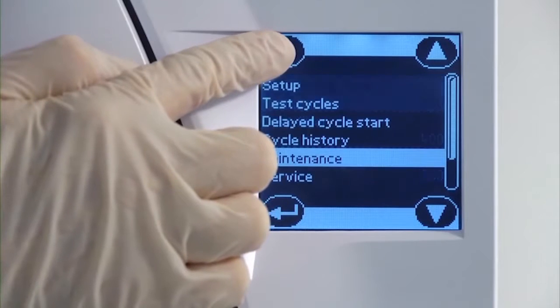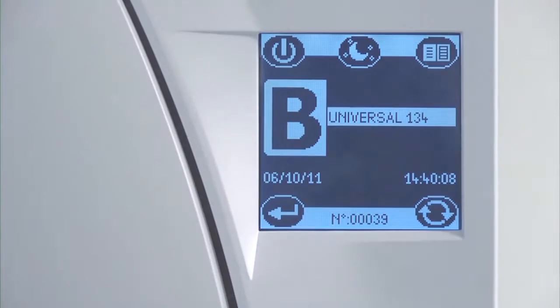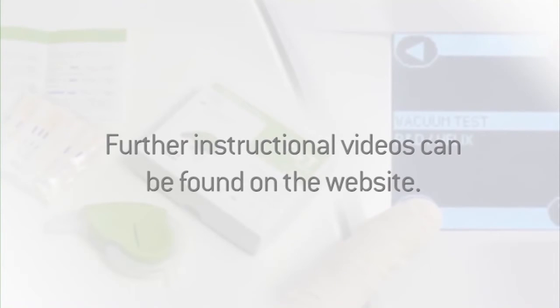Now navigate back to the cycle selection screen to return your Lisa steriliser ready for normal operation. Once the new door seal is correctly fitted, it is recommended that a vacuum test and Helix test cycle be run before returning the steriliser to normal use. The successful test results should be recorded in a logbook. Further instructional videos for performing a vacuum test and a Helix test can be found on this website.